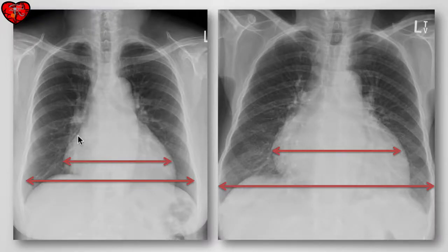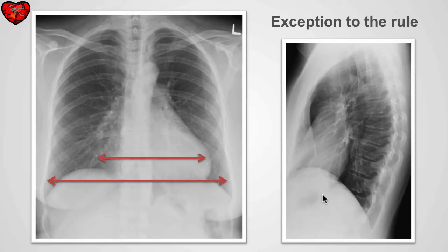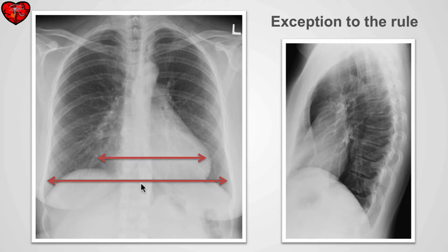In both examples shown, the size of the cardiopericardial silhouette in relationship to the diameter of the thorax is greater than 50% and is abnormal. One exception is if the patient has a pectus excavatum deformity. With pectus excavatum, the sternum lies more posterior than normal, causing mass effect on the heart which is flattened between the sternum and the vertebral bodies. On the PA examination, the heart will look enlarged but only because of this deformity.